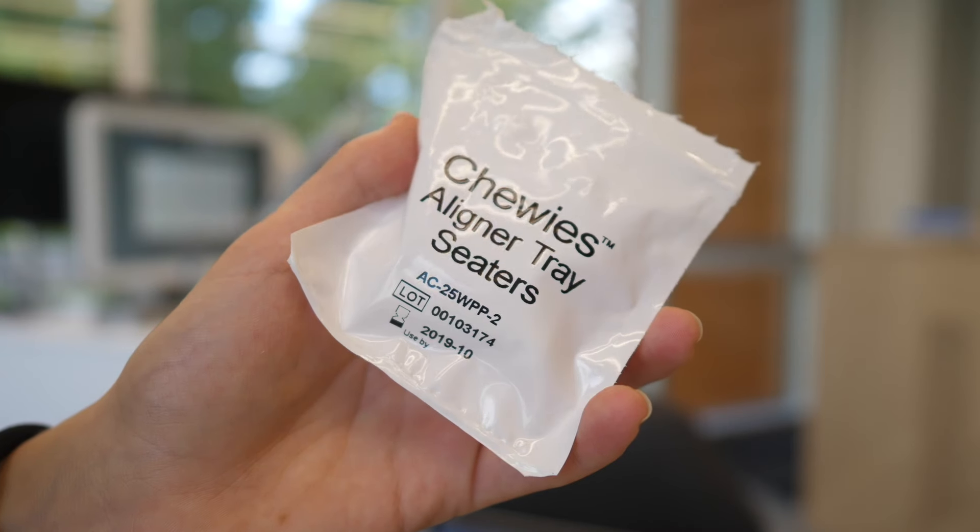Your aligners should be worn for a minimum of a week before changing to the next set. When changing to the next set, it's important that you use chewies. These are crucial for making sure your teeth fit into the aligners properly.